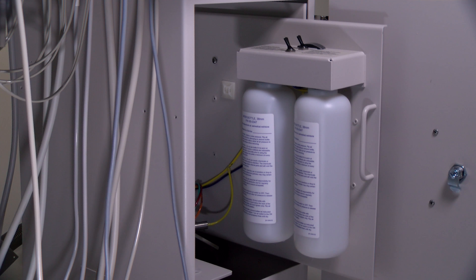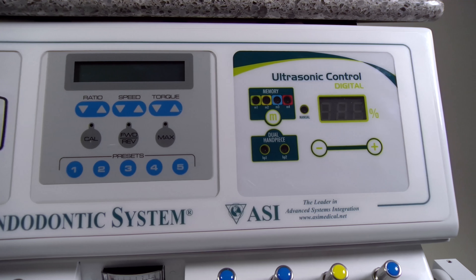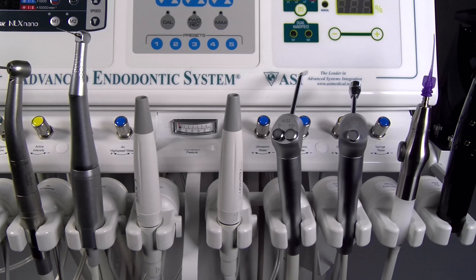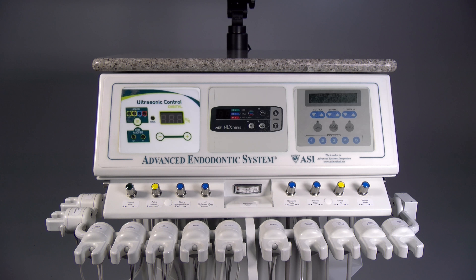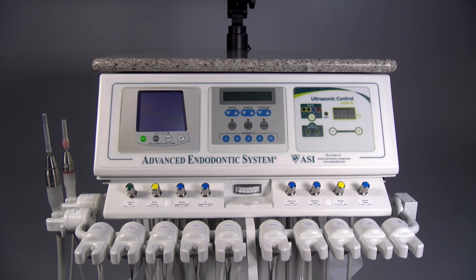The system features ASI's unique modular control panel design that allows a variety of instruments to be integrated internally with operation from only one foot control. The modular design allows customized configuration with electronic instruments of choice to be placed in any order and eases upgradeability in future years as instrument technologies change.